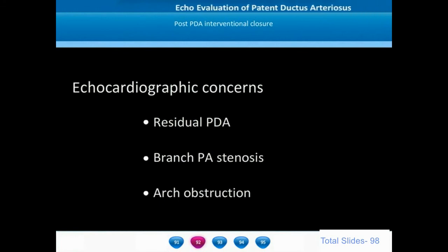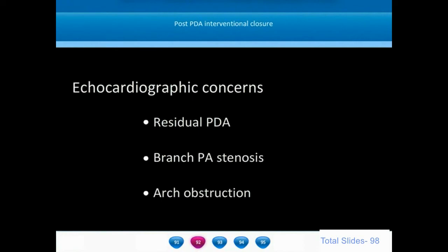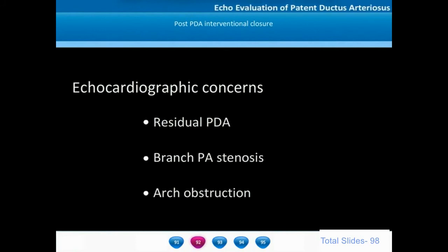Ductus arteriosus are largely closed by interventional methods. When we analyze a patient after interventional ductal closure, we need to look at the echocardiogram for features like residual PDA, branch pulmonary artery narrowing, and aortic arch narrowing.